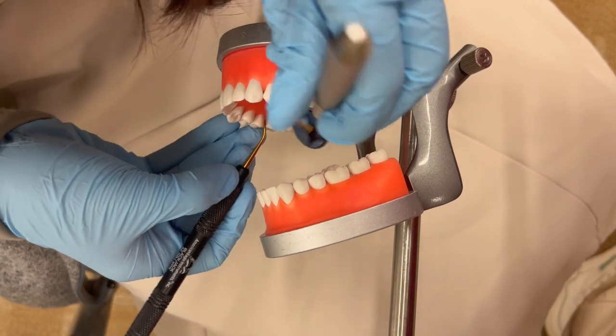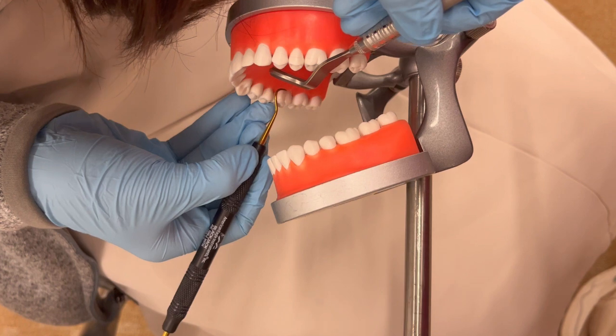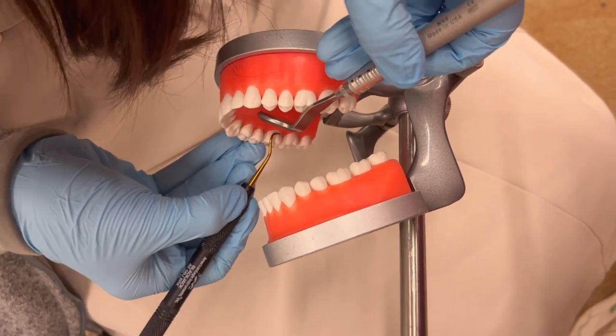So for the facial and mesial surfaces, you want to reposition at the distal facial line angle with the tip facing forward. Then you want to tilt the shank towards the tooth surface, and the tip leads the way.